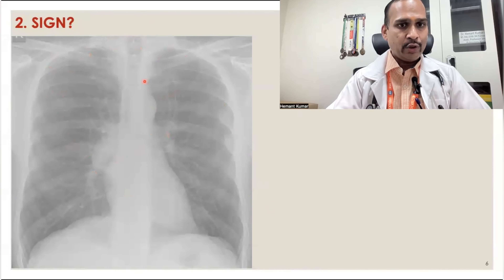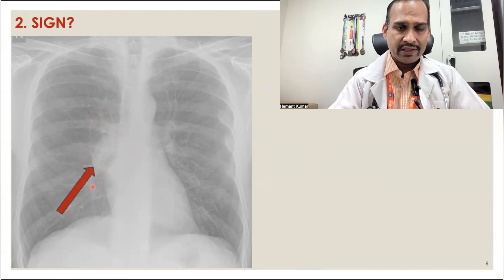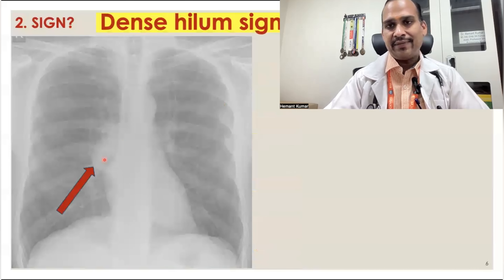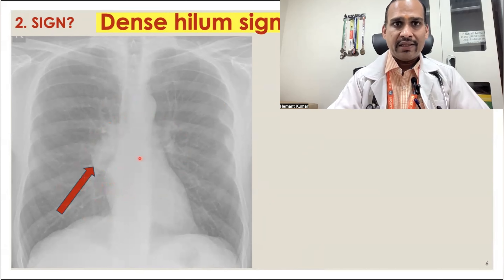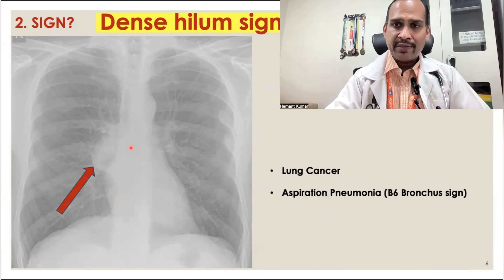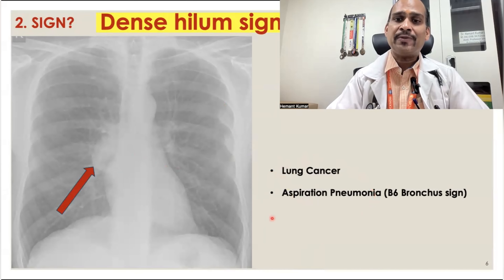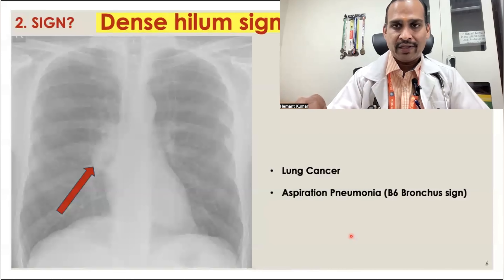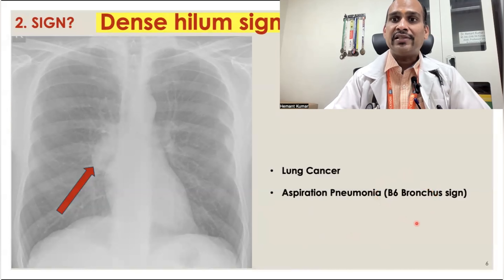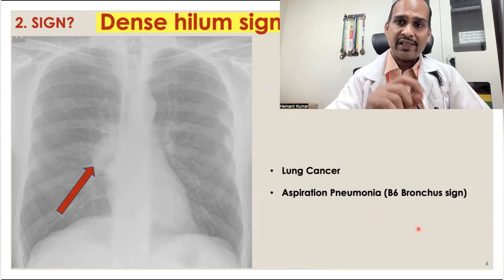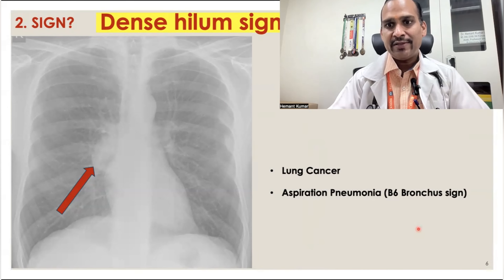Sign 2 is the dense hilum sign. In this X-ray, you can see there is homogeneous opacity in the unilateral hilar region. Any opacity in a unilateral hilum is called the dense hilum sign. If the unilateral hilum is prominent, it may be due to lung cancer or aspiration pneumonia in an ICU patient. In aspiration pneumonia, the segment involved is the apical segment of the right lower lobe — the B6 bronchus.